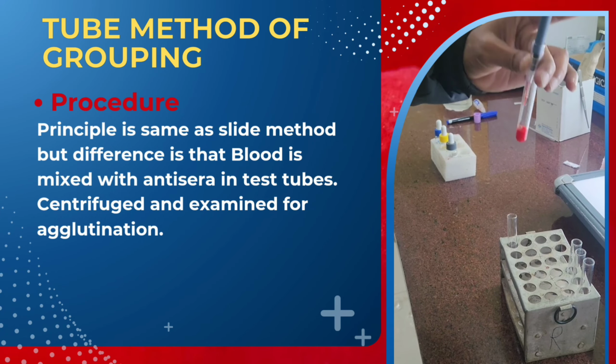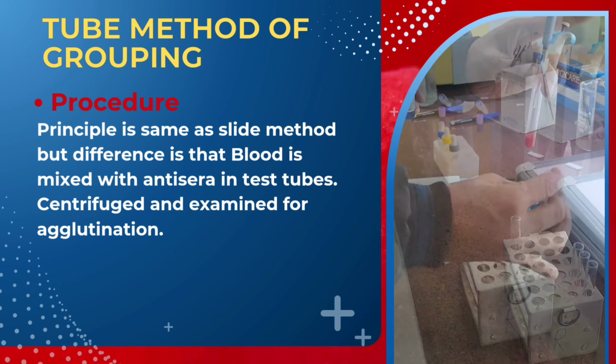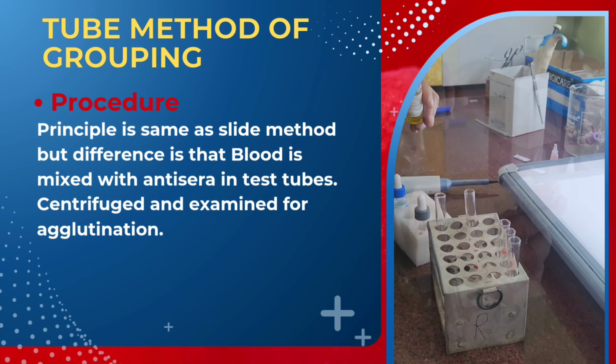In the tube method, the principle is similar to that of the slide method, except it is performed in a tube. It is more sensitive than the slide method.